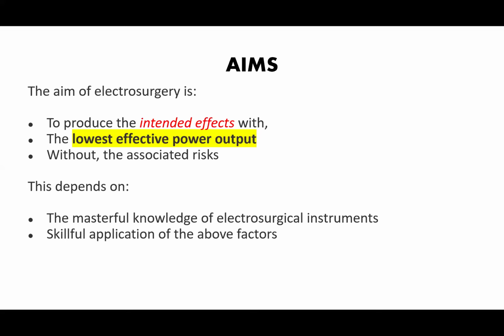With a very high energy output, there is a high risk of developing complication. So you should always reduce your energy source to a low voltage that will give you the desired effect, because this energy that is dissipated on the tissue has a particular effect on that tissue.